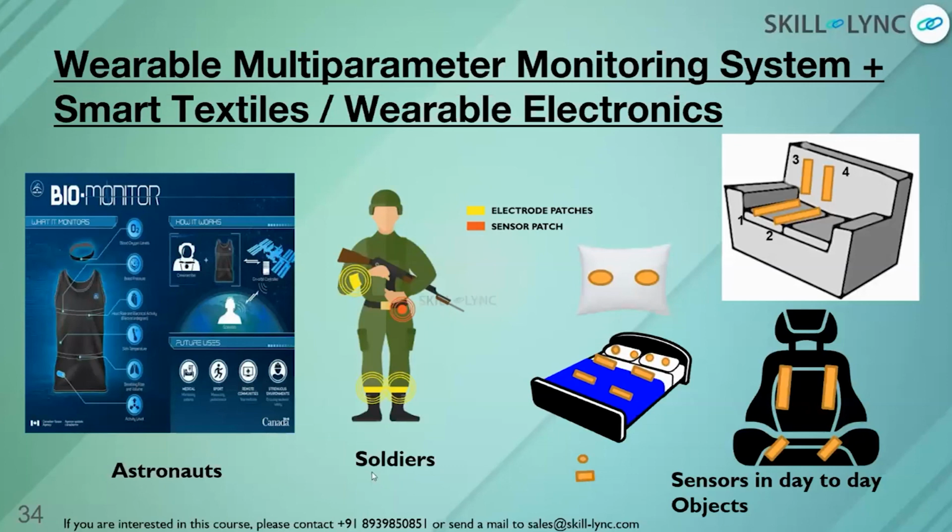So if you are not able to come up with a wireless sensor network, you will have conducting wires. The threads they use in the dress to fabricate will be conductive threads, so that from the sensors, via that conductive thread, the signal will go to the device. You don't need wireless sensors or a wireless communication protocol. The fabric inside the textile itself will act as a conductive yarn.